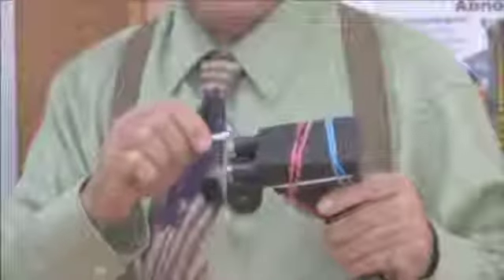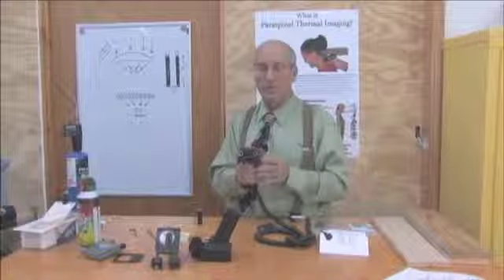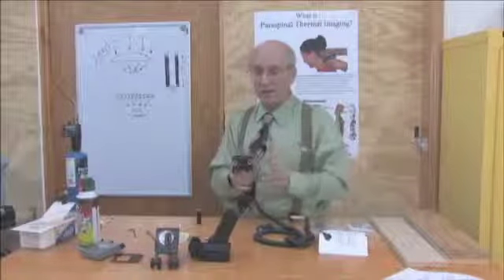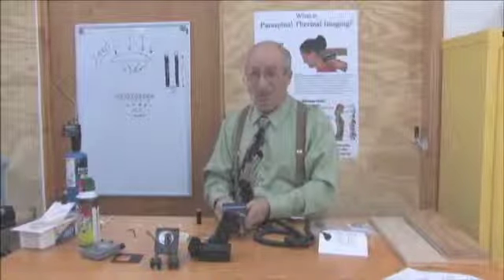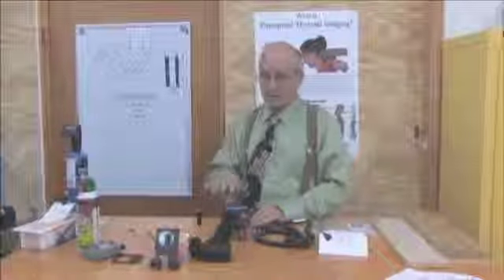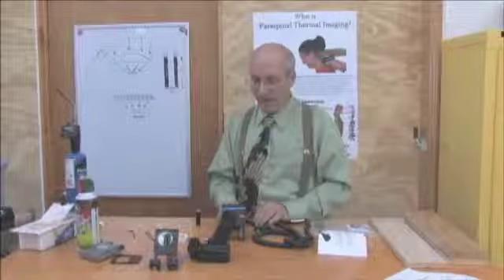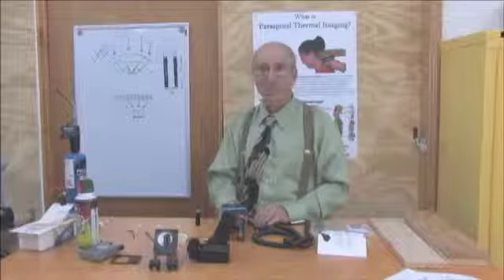And get a new Q-tip and go around the outside just to make everything nice and attractive like it should be. And so we have gotten any dust out, we've gotten any flakes of dead skin out, and the scanner should be perfect again. After any work that you do, touching it, holding it, let the scanner sit in its base for at least 15 minutes so the temperature of the head will become uniform again and acclimate to the room temperature, and you're ready to go.